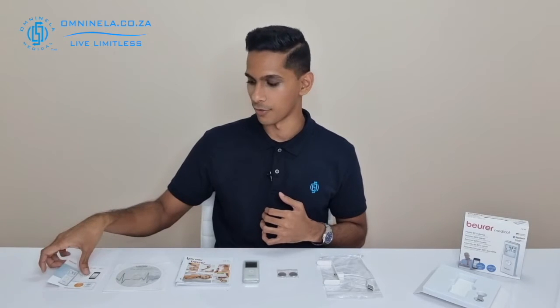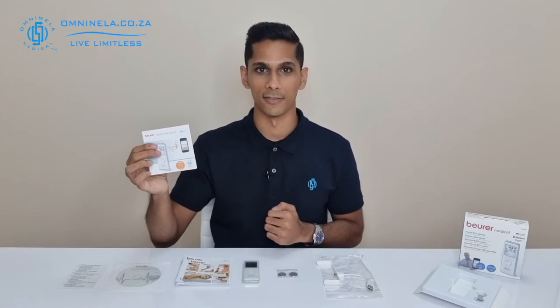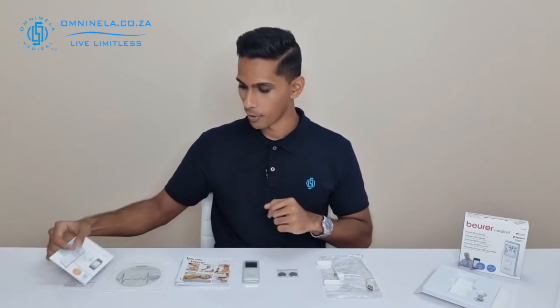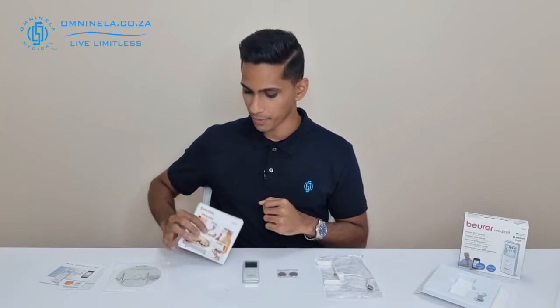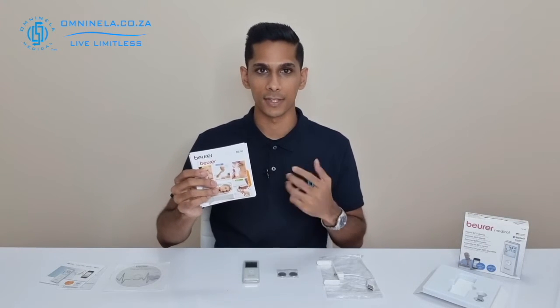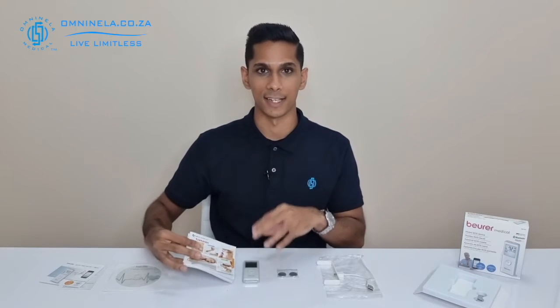Now that we have everything in front of us, we can take a look at it. Firstly, you've got your quick start guide, which is going to help you understand how to start up the device for the first time and find your way around it. More importantly, you've got your user manual, which will show you how to use the device in different methods and also the full functionality of it.